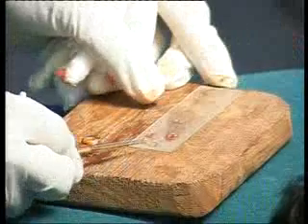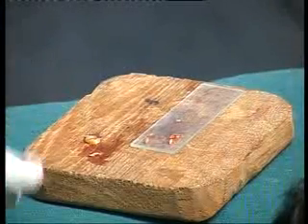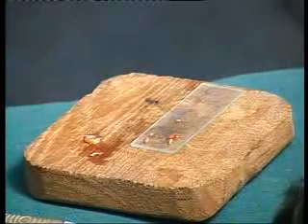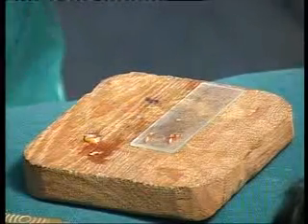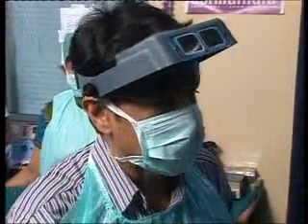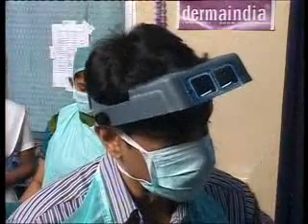I think you are able to see the grafts now. It may contain around 2 to 3 hair roots. You can go in for an 18 gauge needle, or you can use a 1mm punch. It comes as a metal punch, and the metal punch will also be very nice. If we think that harvesting and cutting the grafts is going to be a little bit difficult, you can go in for a 1mm graft from the donor area, which will contain 1 or 2 hair roots.